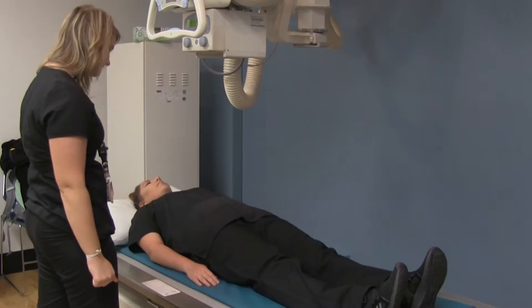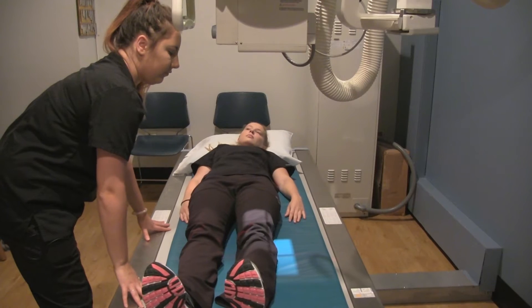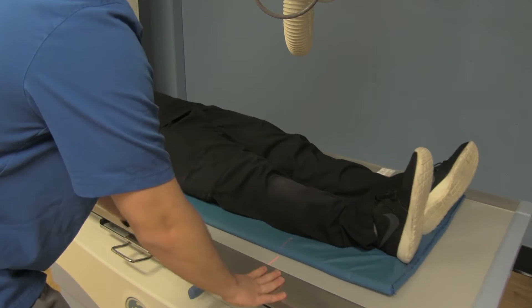Our table also moves up and down and side to side, just in case our patient may be a little off-centered or crooked.